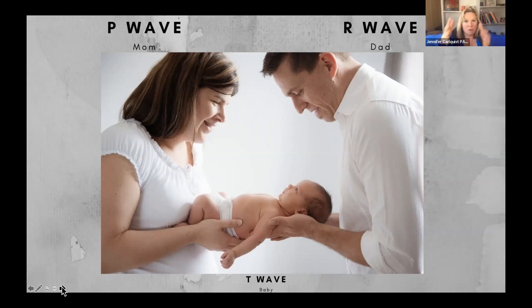And they should all be holding hands together along the EKG. That's what normal is, right? The mom shouldn't be too tall. The dad shouldn't be too tall, right? Everybody should be their own appropriate size. And of course, the baby should be nice and close to his own dad, not running off to his next mom. And that will help you, again, the relationship between the mom and the dad when we're doing heart blocks, which we will have a couple for you at the very end.